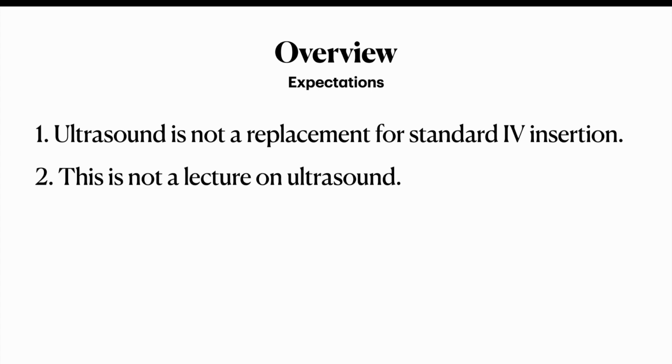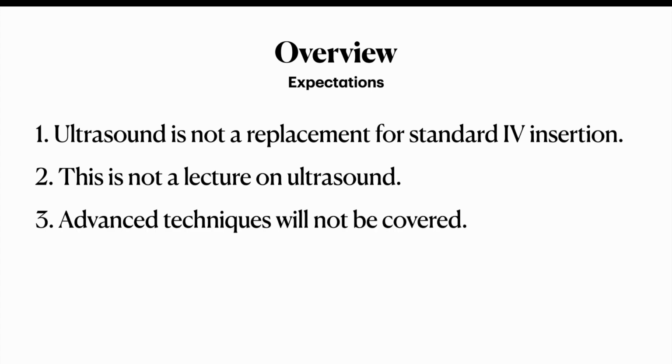Number two is that this is not a lecture on ultrasound. While we will cover a few basic principles so that you know how to use the ultrasound to perform this procedure, we will not bog you down with any unnecessary details. And finally, advanced techniques will not be covered.